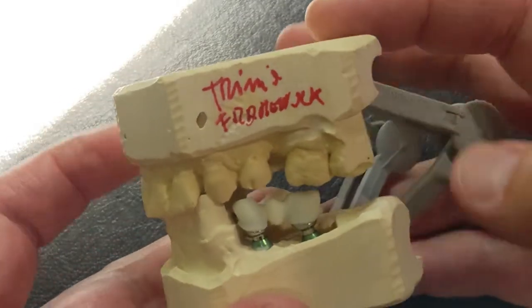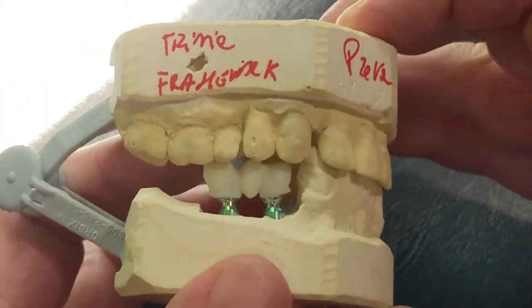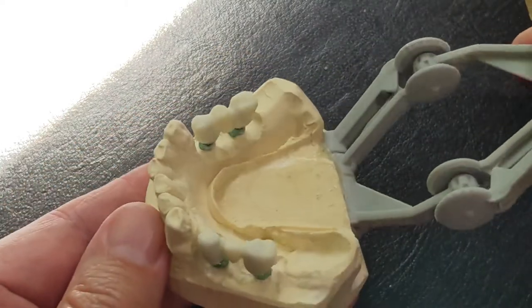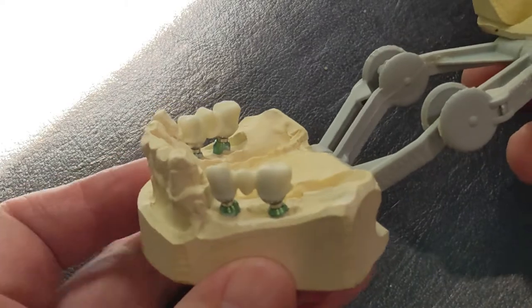Today's video is a little bit melancholy. This is a couple of dental implant bridges that I will never get to finish. Well, technically I can finish them, but I'll never deliver them to the patient.